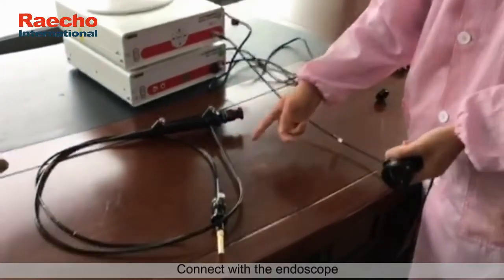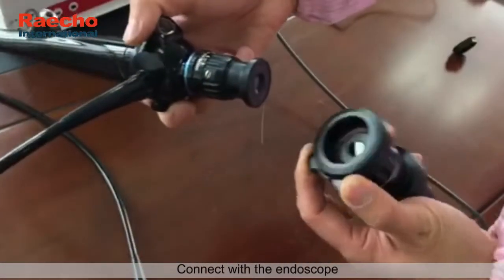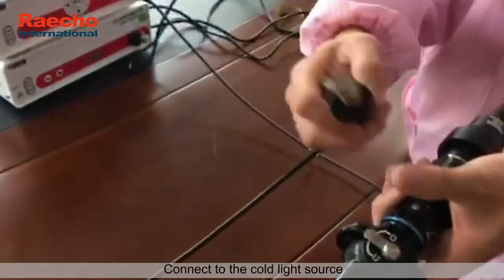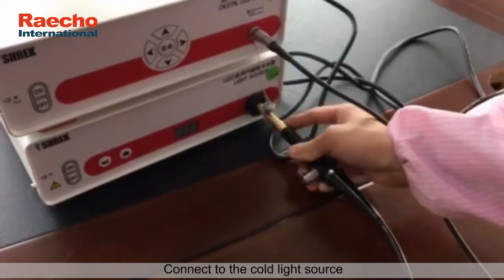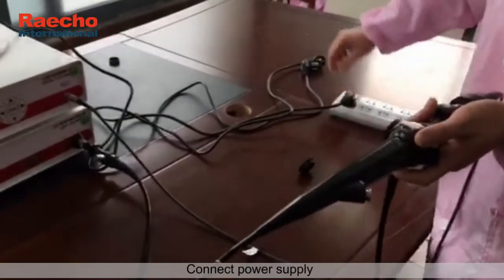Connect with the endoscope. Connect to the cold light source. Connect power supply.